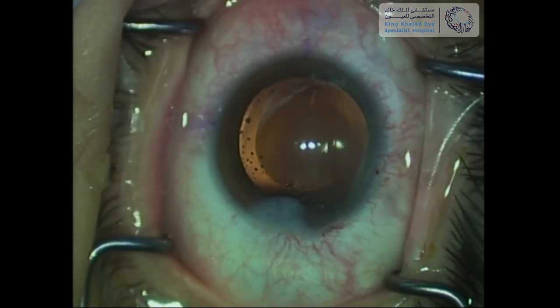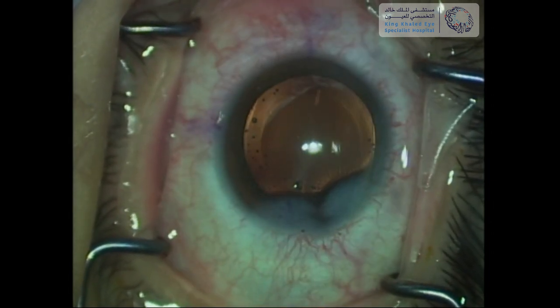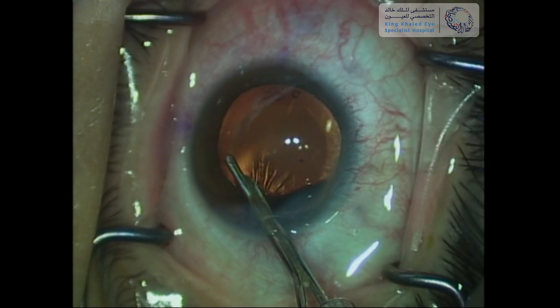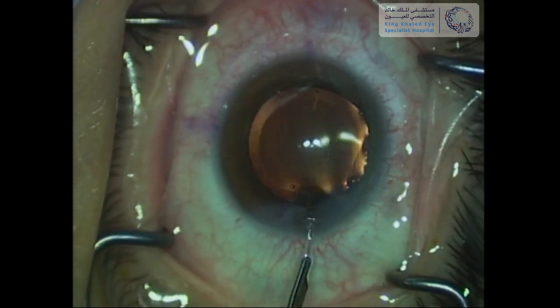The main corneal wound is hydrated with a BSS cannula. The Simcoe cannula is used for viscoelastic removal. It is very important to remove viscoelastic thoroughly to avoid IOP spikes post-operatively.